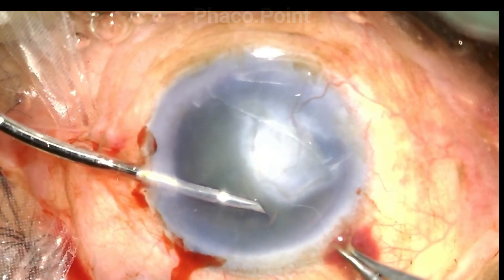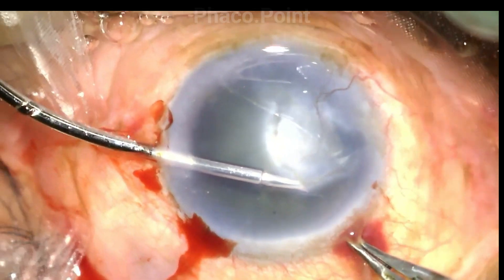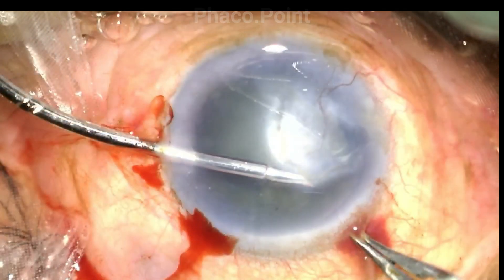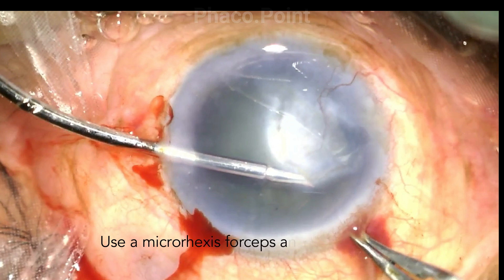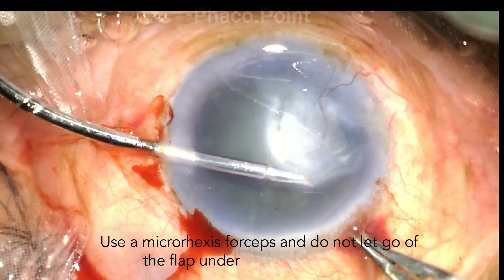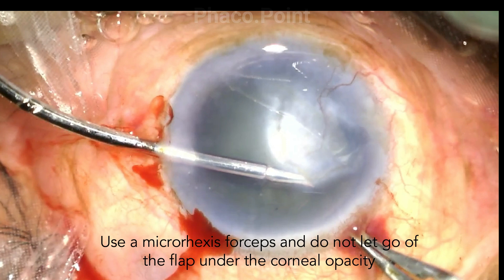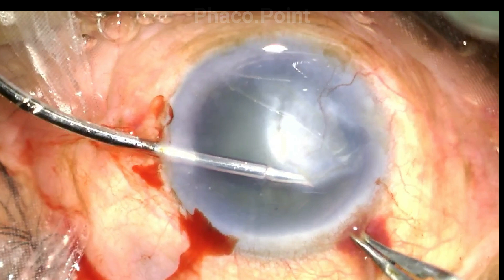Because I'm going to lose sight of the rhexis edge as I advance towards and under the corneal opacity, I like to perform this step with the help of intraocular forceps. The most important trick here is that when you get hold of your capsule, do not let go of it when you are under the corneal opacity.